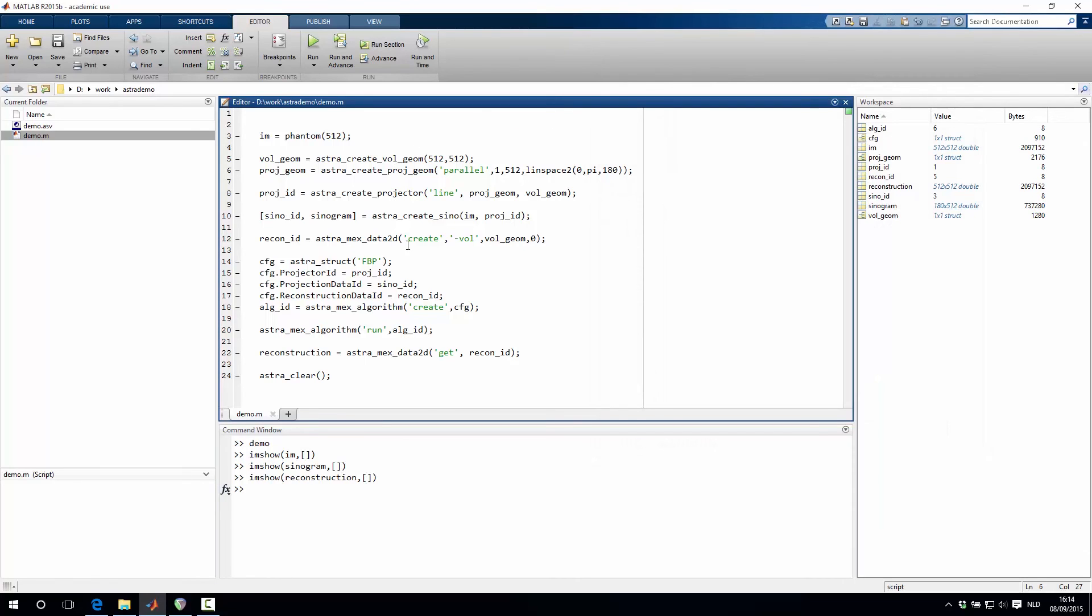All right, so this is an implementation that is based on the CPU, which is of course very nice. But this can be a lot faster, namely with the GPU accelerated version.